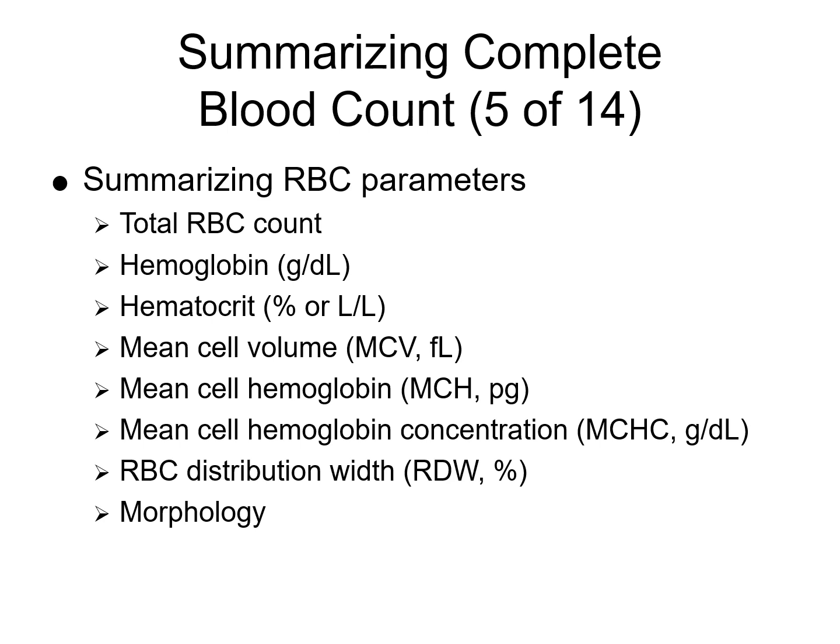For your red blood cell, we have your total red blood cell count. This measures the number of red blood cells per microliter of blood, which is important for assessing overall erythrocyte quantity. Hemoglobin is the concentration of hemoglobin in the blood, reflecting oxygen carrying capacity. Hematocrit is the percentage or fraction of blood volume occupied by red blood cells.